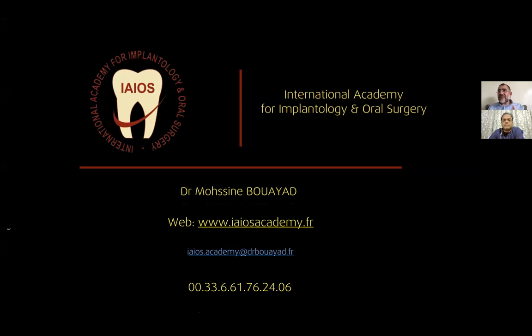When I have more than 4 or 5 millimeters of residual bone, I frequently don't put bone grafting. I only put PRF and CGF because I have enough bone for primary stability of my implant, and with the blood clot and the new regeneration of the bone, I am sure that after a few years I have newly formed bone around my implant, so I can put my implant without bone grafting.